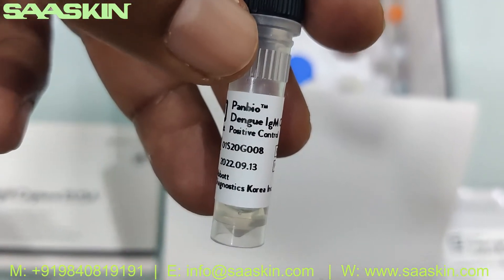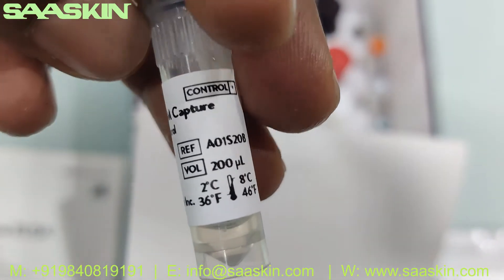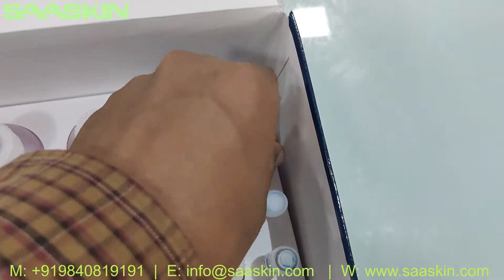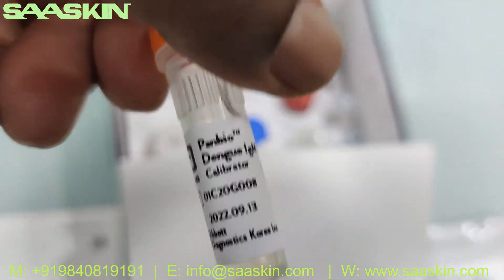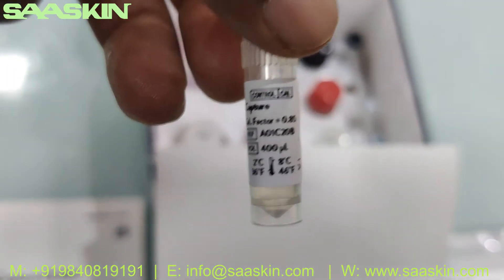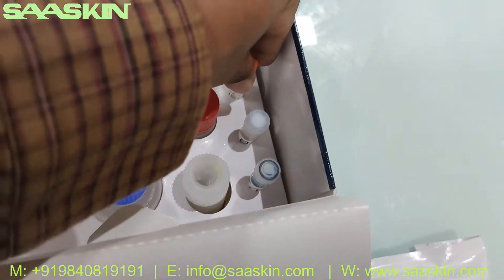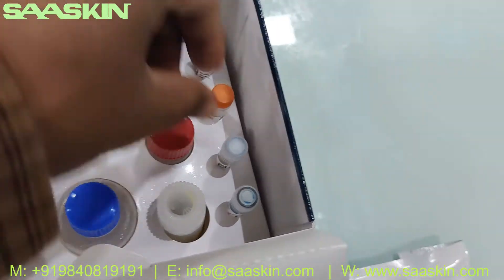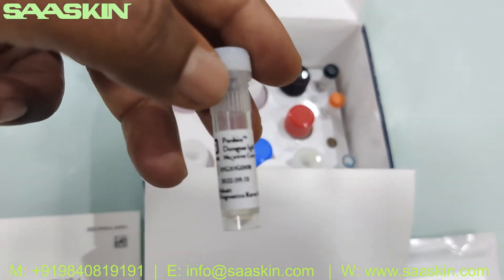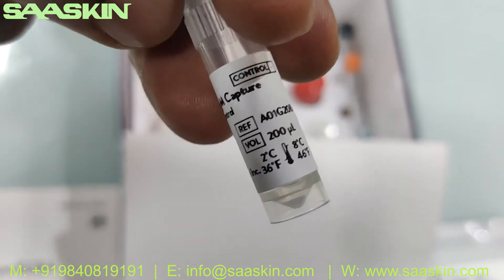This is the Panbio Dengue IgM Capture positive control — 200 µl. And you have the Panbio Dengue IgM Capture calibrator — 400 µl. And we have the Panbio Dengue IgM Capture negative control — 200 µl.